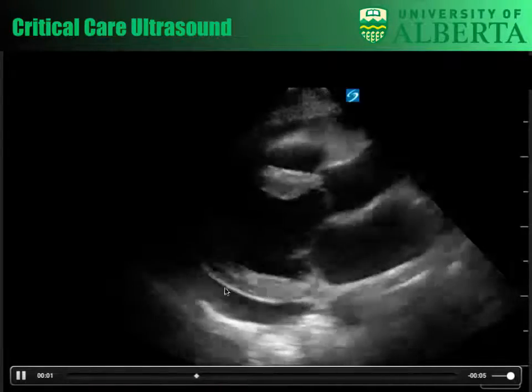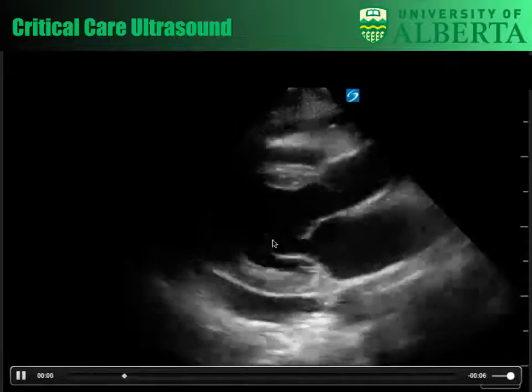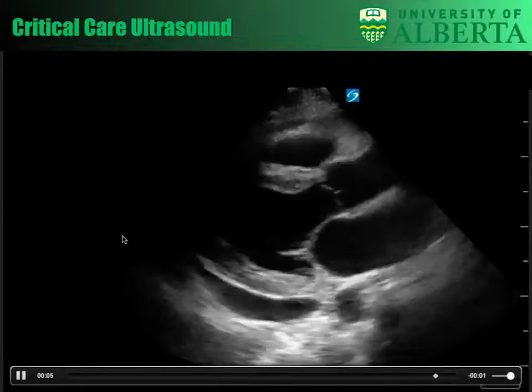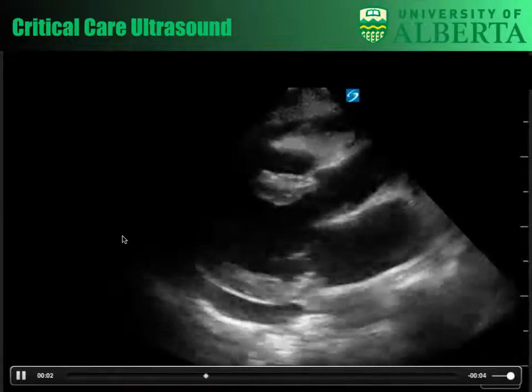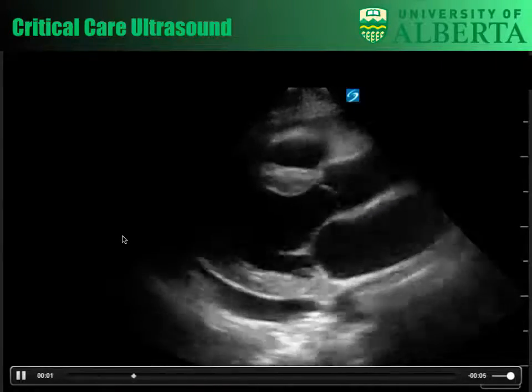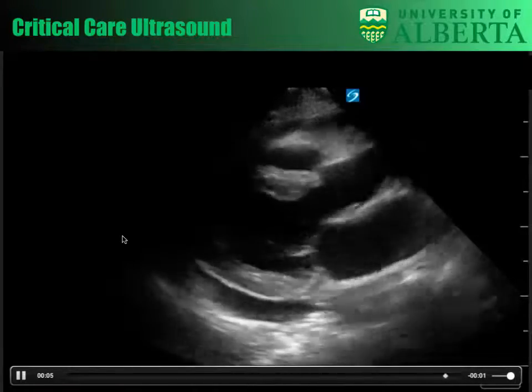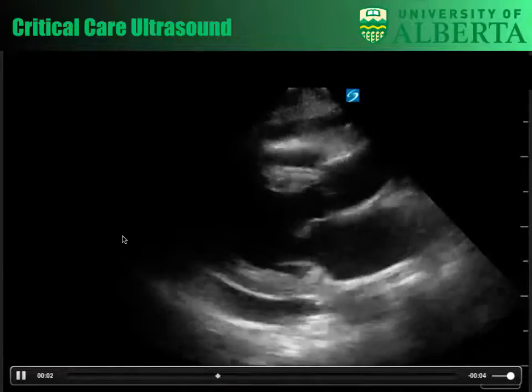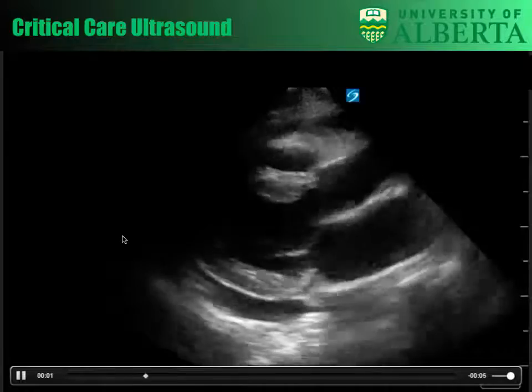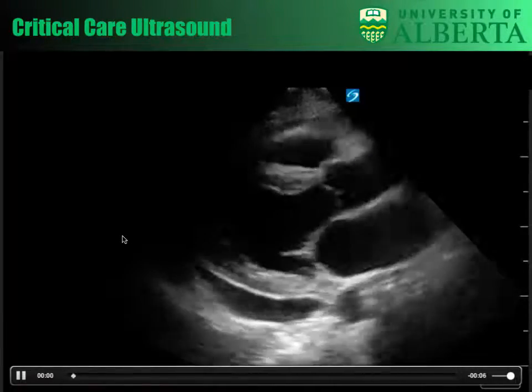Now, just looking at this, this is not our main focus, but what do you think about the left ventricle here? Any impression of what you see there? Definitely, I would say reduced EF. Not that expert. That's fine. The main focus of this talk is not on left ventricular function, but this LV function is grossly reduced. The percentage is not the main focus. The focus is really that there's probably a reduction in function here, which I think you noticed. And that's really the main point.